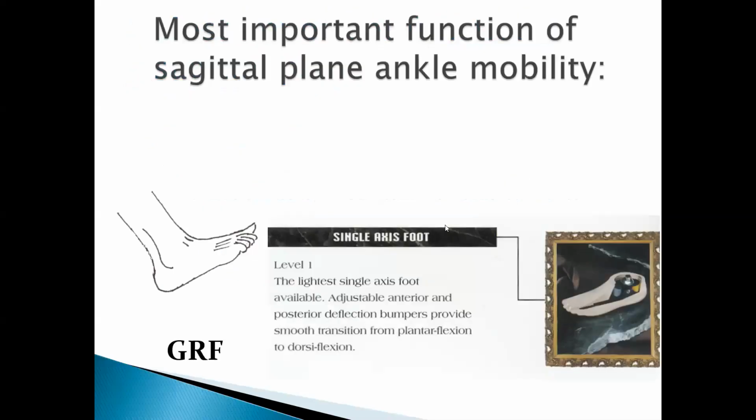Okay, so here is an example of a single axis foot. So again, to emphasize and illustrate what we were talking about before. There's the ground reaction force coming from the heel, and there's the external plantar flexion moment.